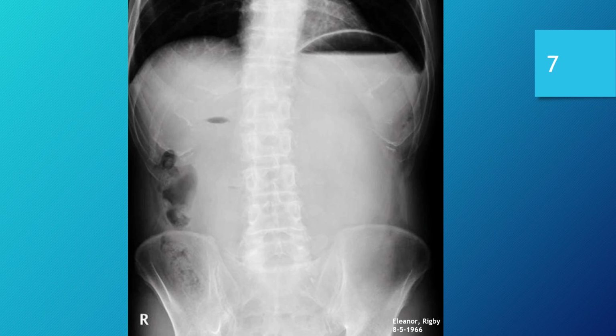Okay, moving right along. We have a new picture here, and some important things that we get to talk about for this image. First and foremost, let's make that determination about anatomy. Is all the required anatomy present? Well, get our reference markers. And I like using these because it gives us an idea of the parameters of where we're looking and what's in between those areas that we want to see.